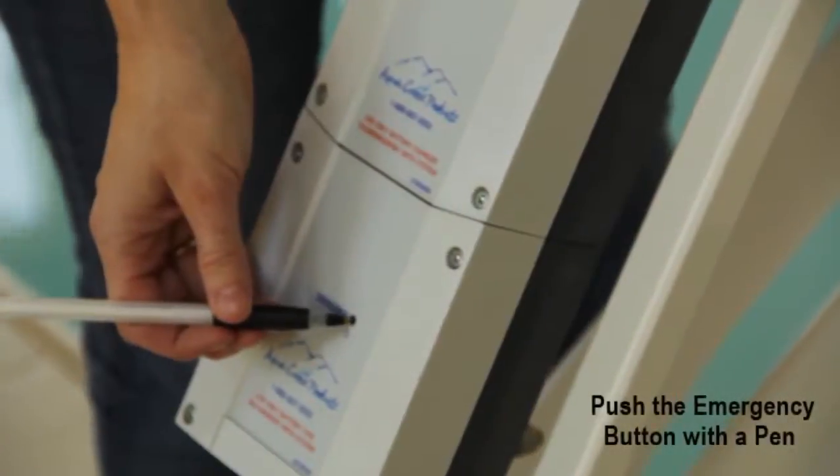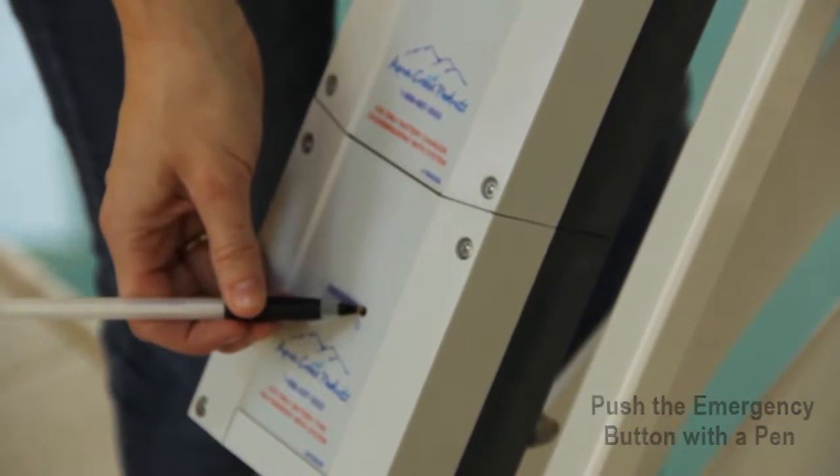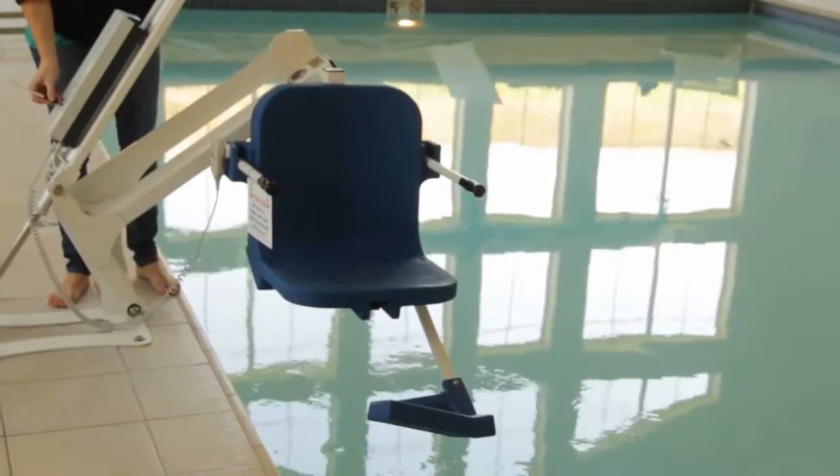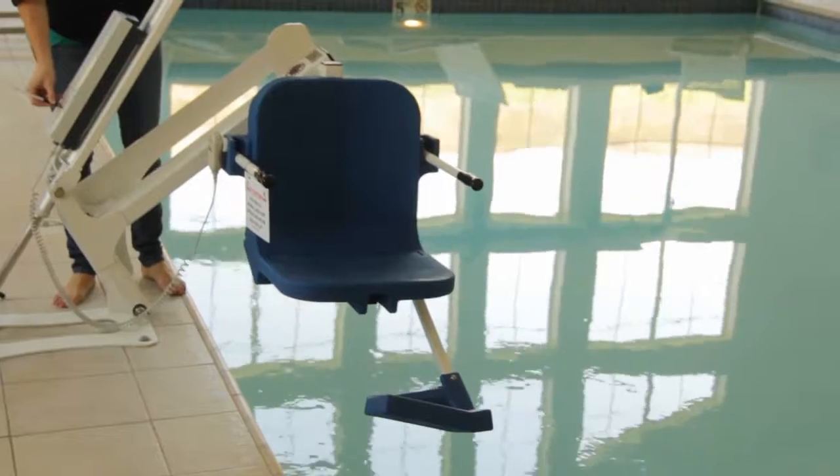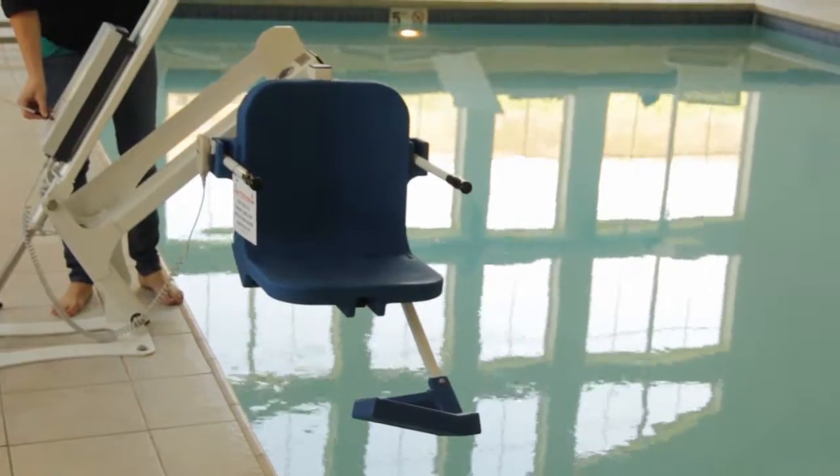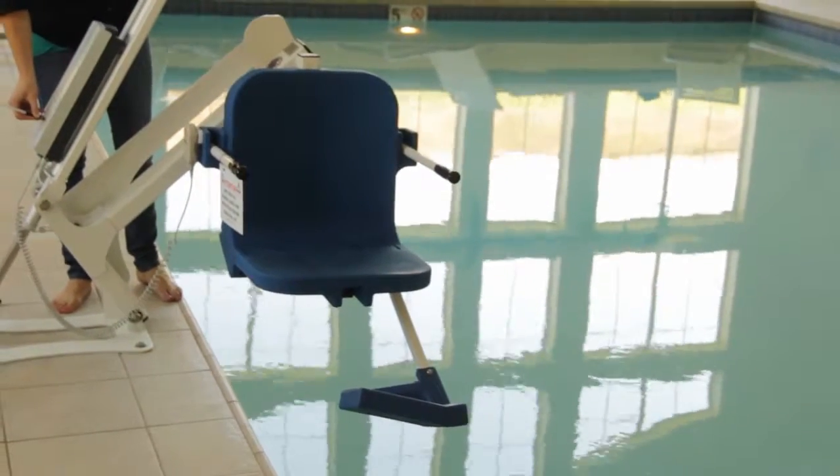First, take a small pen and push the emergency button on the control box. This should retract your lift to deck position, indicating you may need to replace your remote handset. Please call customer service.